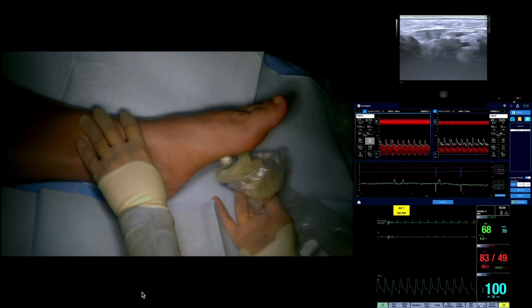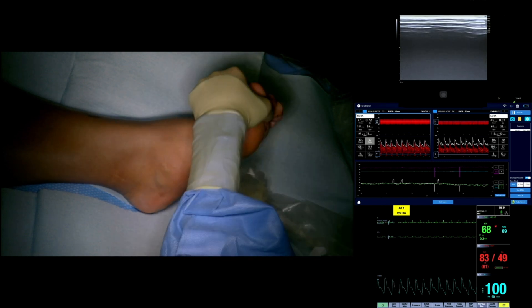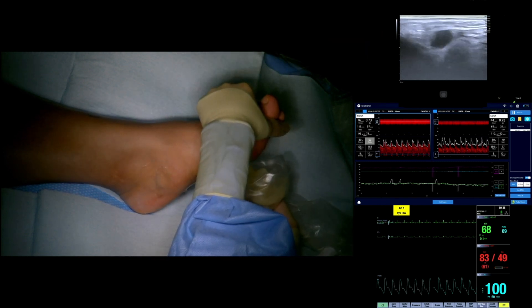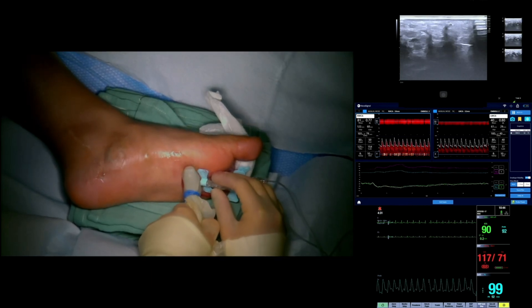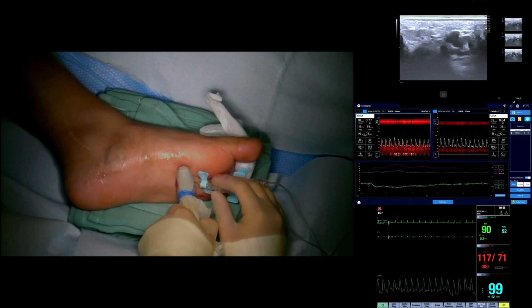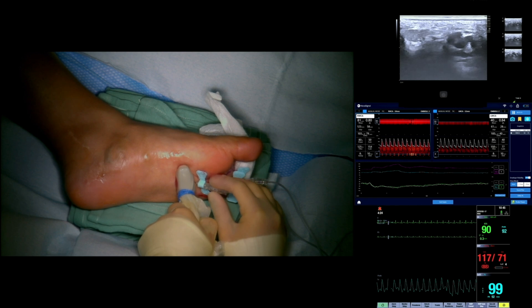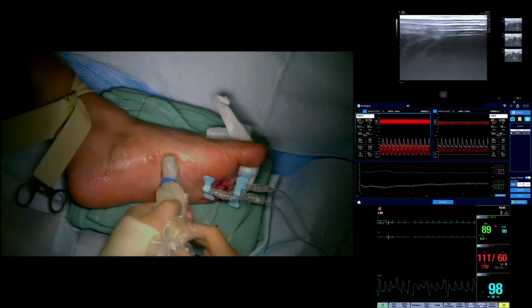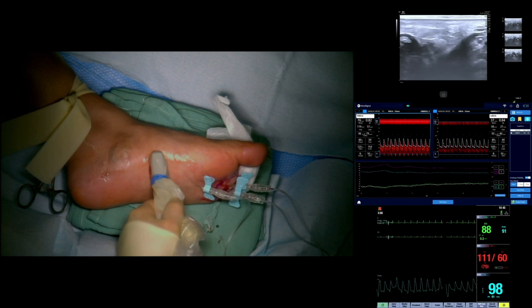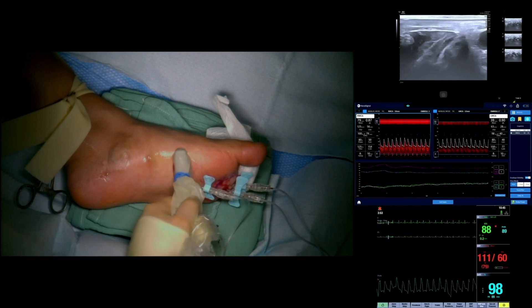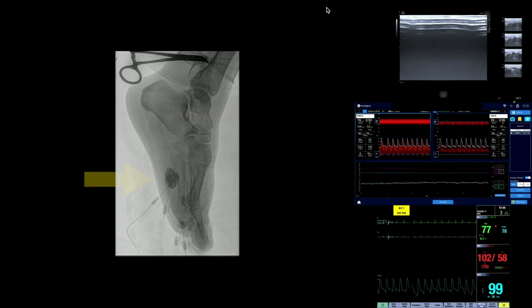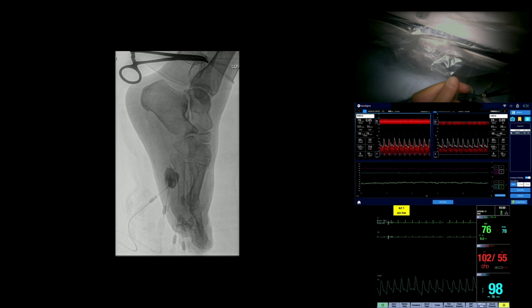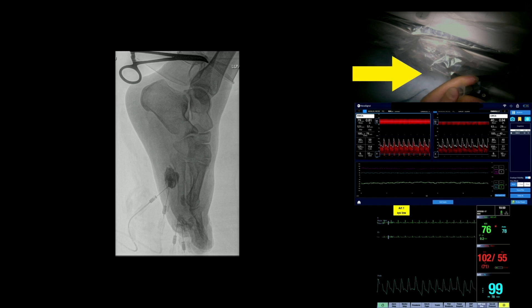Ultrasound guidance was used to identify multiple areas of varicosities along the undersurface of the left foot. Several of these were already thrombosed. The patent varicosities were successfully accessed using butterfly needles under ultrasound guidance. A tourniquet was applied around the ankle to hinder venous flow from the foot, which also engorges the venous structure of the foot, allowing easier vascular access. General contrast injection verified the presence of AVMs. Sodium tetradecyl sulfate was then injected into each of these access points.